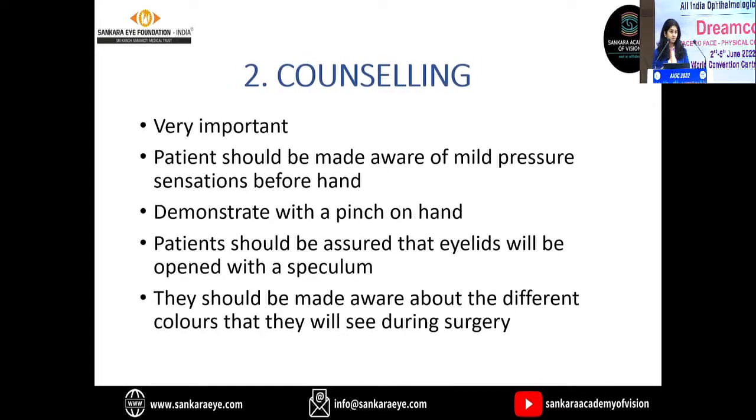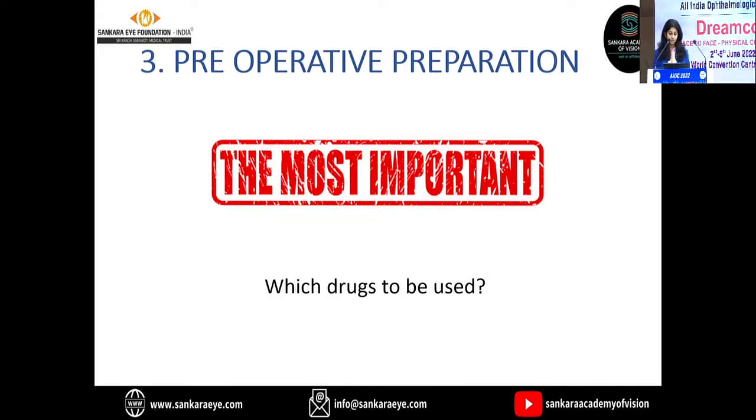Again, counseling is the most important step. The patient should be made aware of the full procedure, because we tell them there is no injection, so the patient feels that it's going to be a painless surgery. Of course, it's going to be a painless surgery, but the patient will keep on having some mild pressure sensations, so that has to be made aware to the patient. Maybe we can demonstrate it with a pinch on the hand. Many people have a doubt: movements I'll control, but how will my eyelids be kept open? So we have to tell them the role of the speculum. Also, the visual sensation is not lost during topical surgery, so we have to tell that also to the patient.